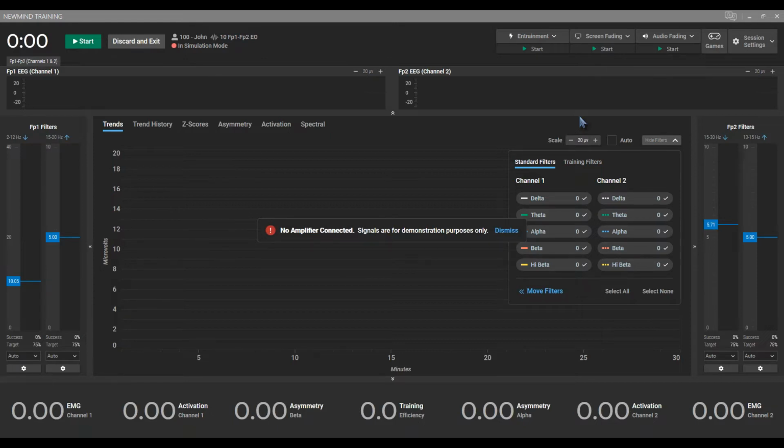For those of you who have not integrated Photic with neurofeedback, I do recommend it. I've worked personally using Photic with neurofeedback since I started in neurofeedback 12 years ago. The equipment I was using back then was heavily based in Photic, so I've seen how wonderful it can be. If you've never tried Photic, get a pair of glasses. I would recommend getting white, since the white glasses are emotionally neutral. Those would be the best option.